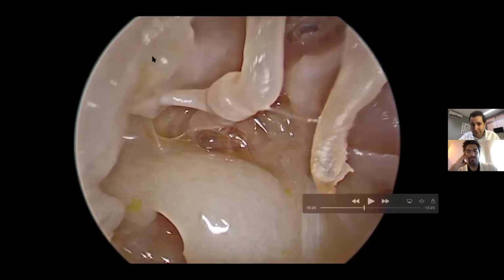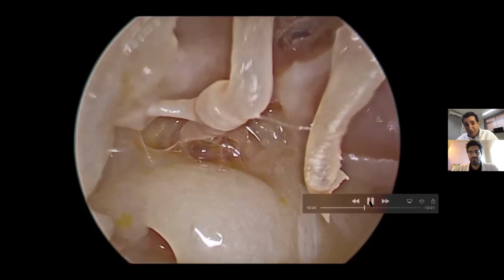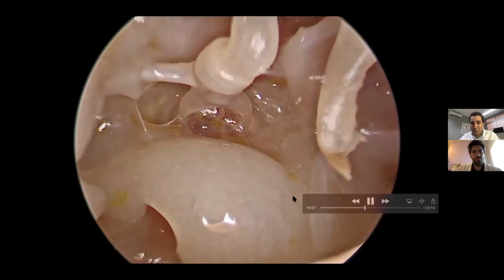So we have the facial recess here, sinus tympani, posterior sinus or anterior sinus, sinus subtympanicum, promontory of the cochlea, Jacobson nerve, supratubal recess, which is the third most important area when we talk about residual cholesteatoma, and the anterior tympanic space. So you can see this just by elevating a tympanomeatal flap. I didn't correct anything yet. And in real life, it's like this, especially when you have cholesteatoma, because the cholesteatoma has already done part of the surgery for you, since it erodes a little bit of the attic area. So you have all this region.